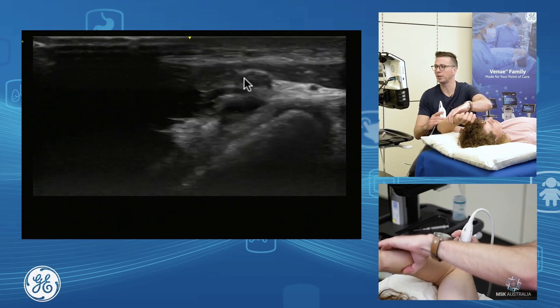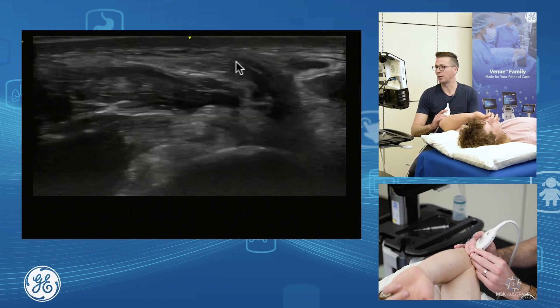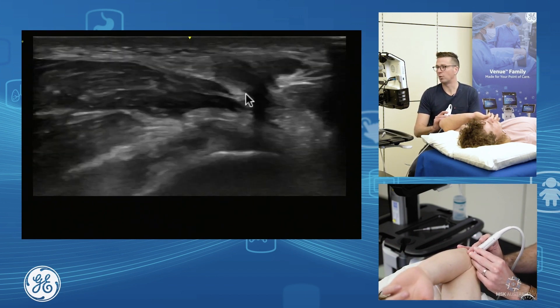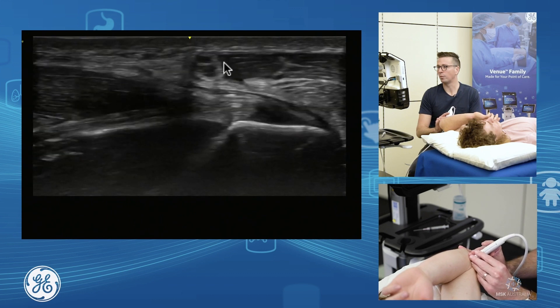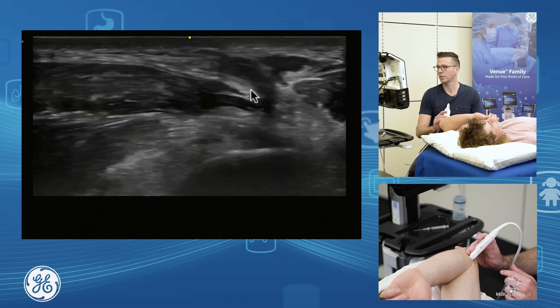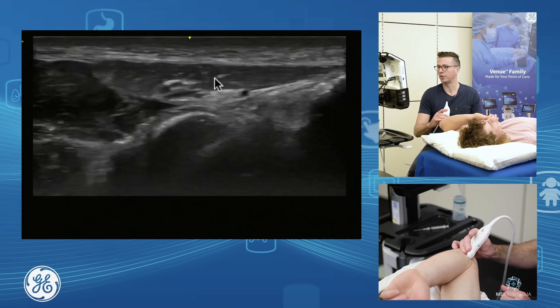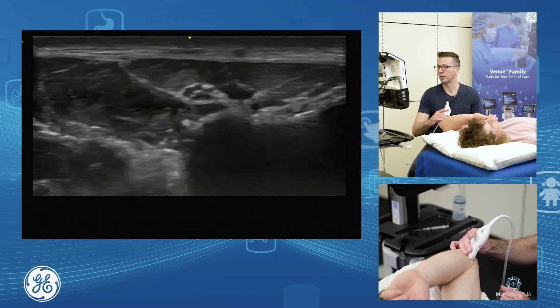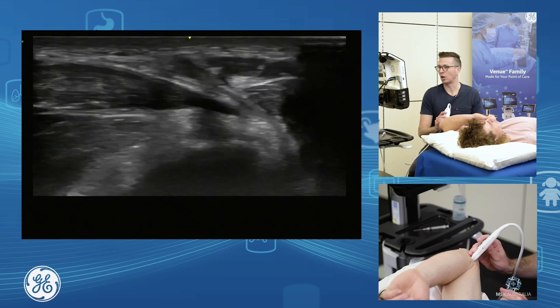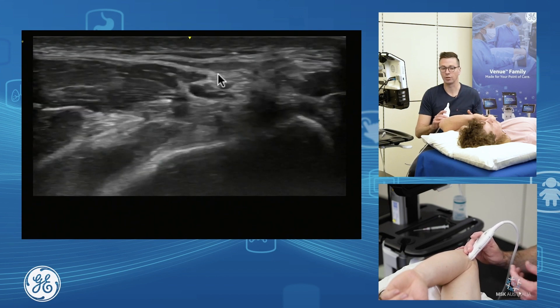Adding a bit more flexion — just put your hand on your chin — we can see the ulnar nerve goes from sitting on top of the common flexor, quite a long way on top, to wrapping around the FCU aponeurosis, and then going down into the forearm. So this is our common point of FCU entrapment: between the two heads of flexor carpi ulnaris.